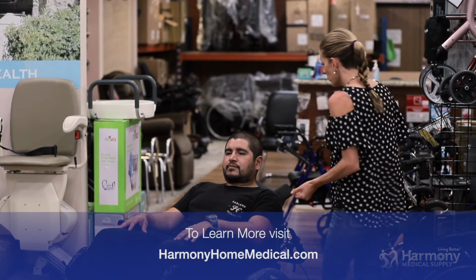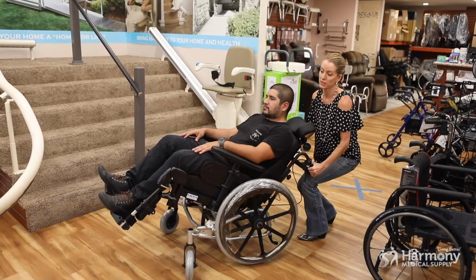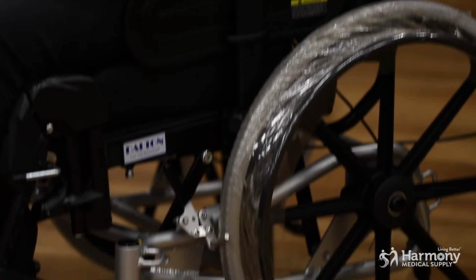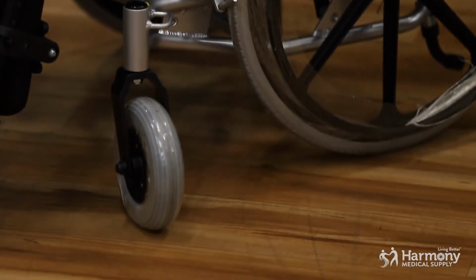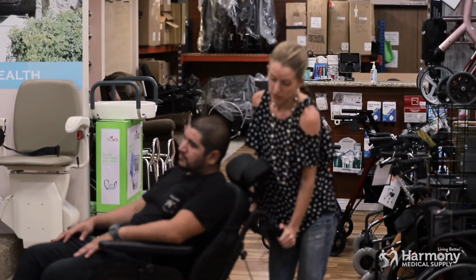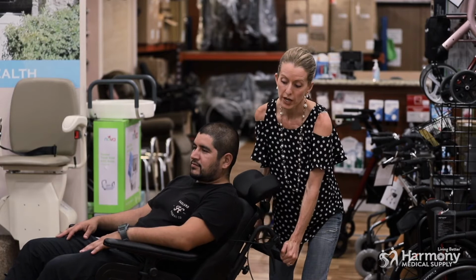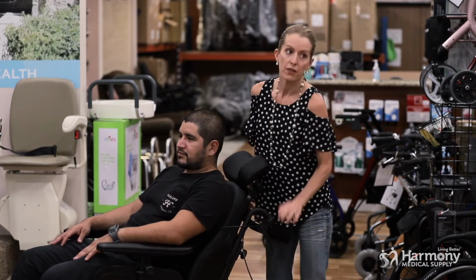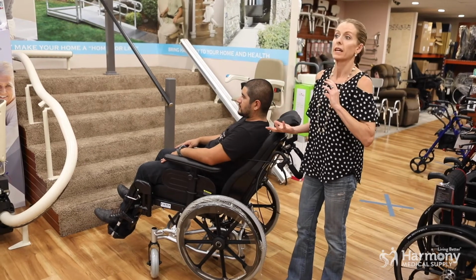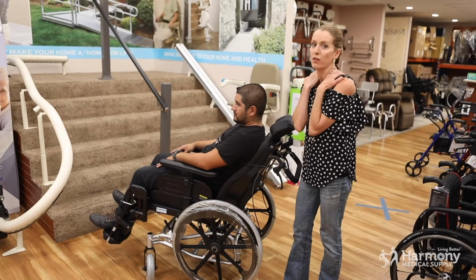It also feels really good when you've been sitting in a chair all day, and it doesn't matter if it's your wheelchair, your office chair, whatever chair, when you can change position like that. So again, a little recline and a little tilt can go a long way to preventing pressure sores and pain in a wheelchair. Another feature that it has that can help is the headrest and supportive backrest for kyphosis.